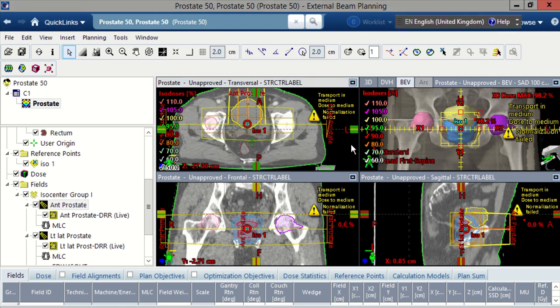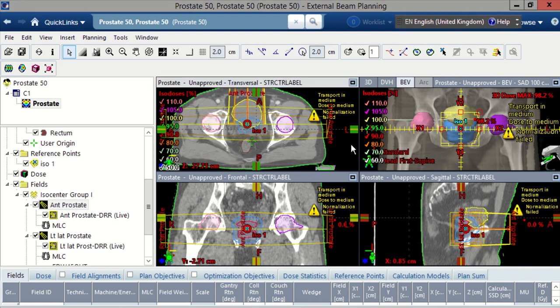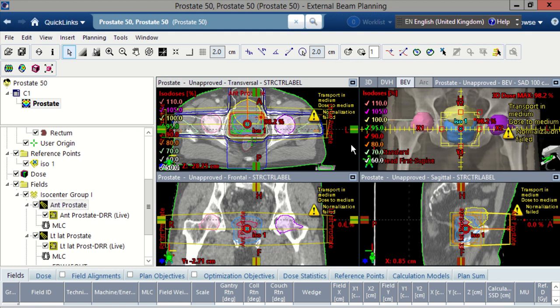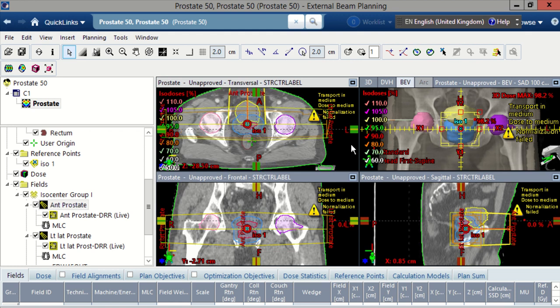When you plan, the first thing you do is outline the structures that you both want to treat and avoid. If you have a look at this slice up here, you can see that we want to treat the prostate, but we also want to avoid things like the bladder, the rectum, and the femoral heads.